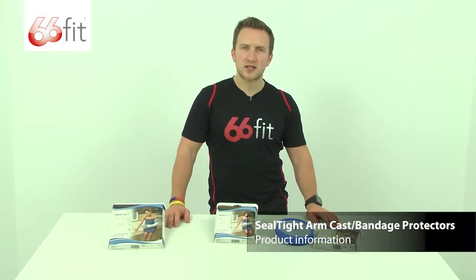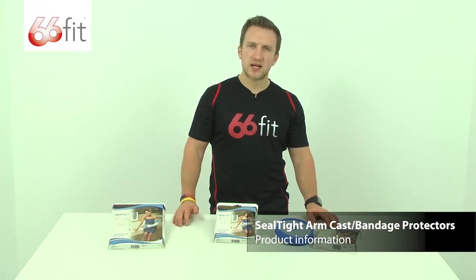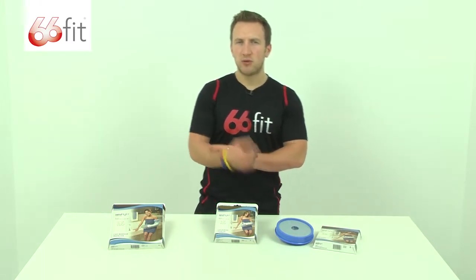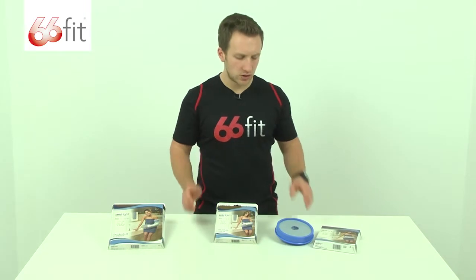This is the range of Seal Tight cast and bandage protectors provided by physiosupplies.com. These are designed to provide protection whilst bathing or showering to a cast or a bandage, but not whilst swimming. They are not designed to be used in a swimming pool, only whilst showering and bathing.